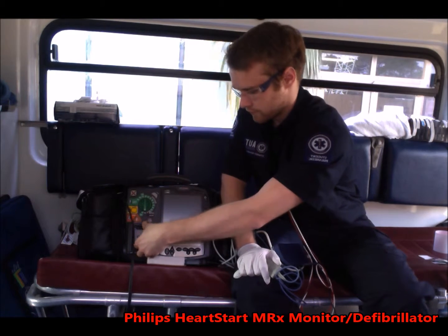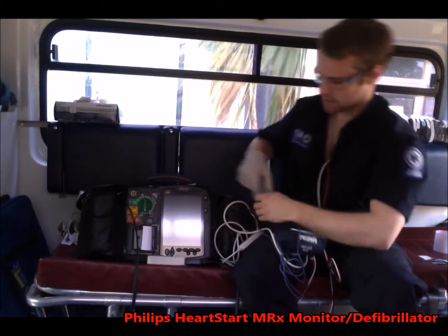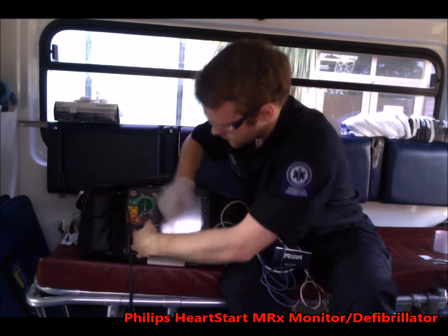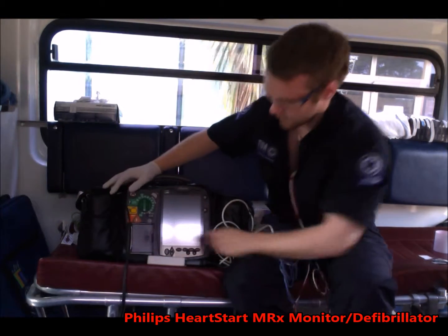This was quite full. We do have a spare in the back, so we want to place this one back in. Make sure it's sitting in nicely. Pull a little bit of the paper through. Make sure it's even, and then just clip it back in.